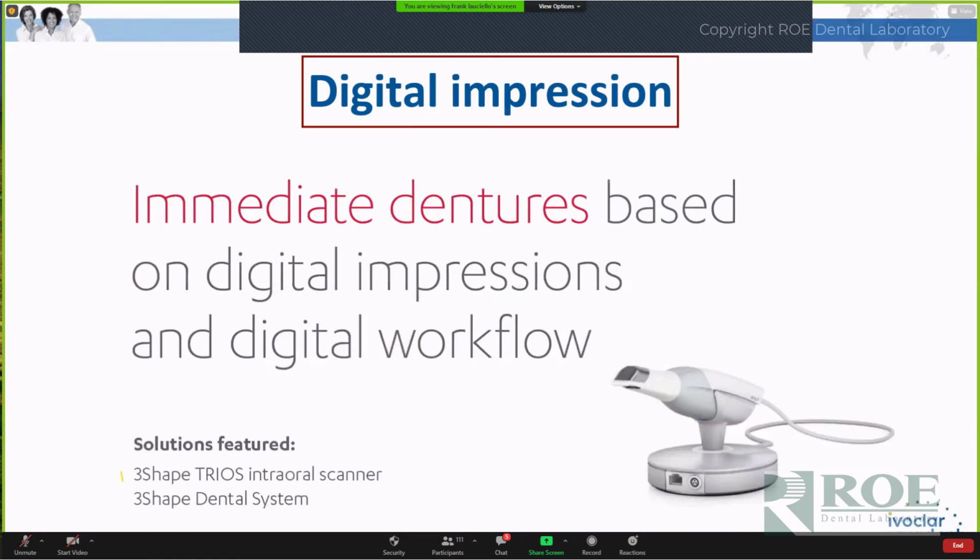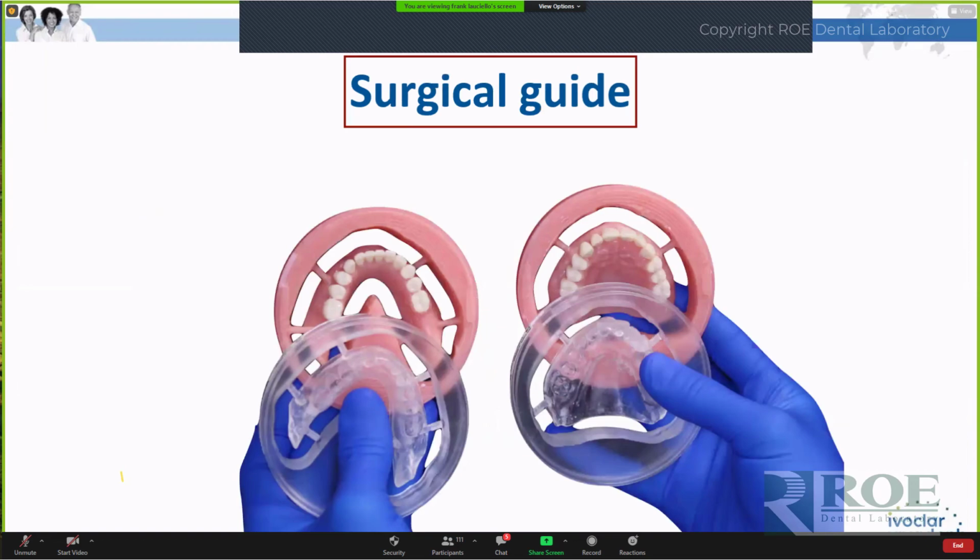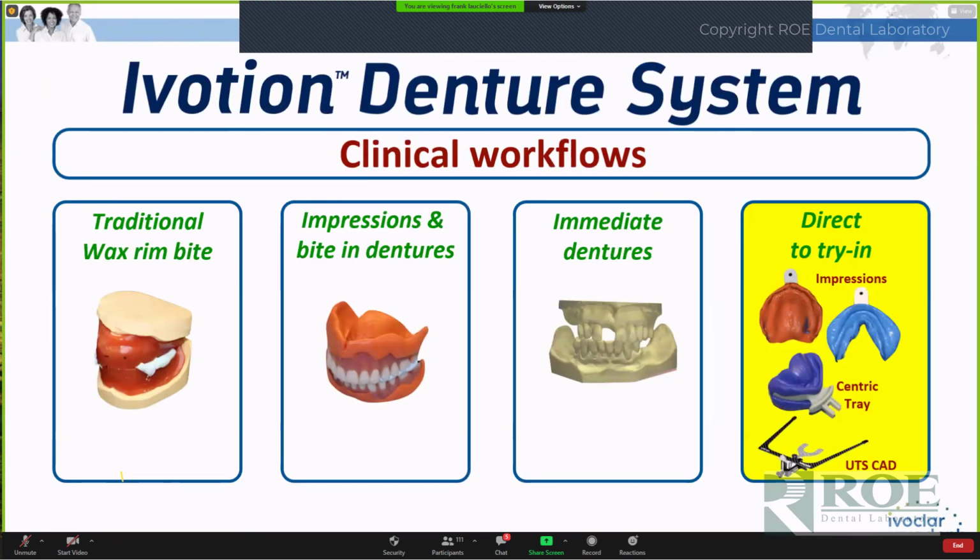So we could also look at an intraoral scan, as I mentioned, and developing your skill in this area would probably be a smart thing to do. Should we have a surgical guide? Your call. If you do a lot of alveolectomy, I certainly recommend having a printed clear surgical guide, which would be a practical thing to have.